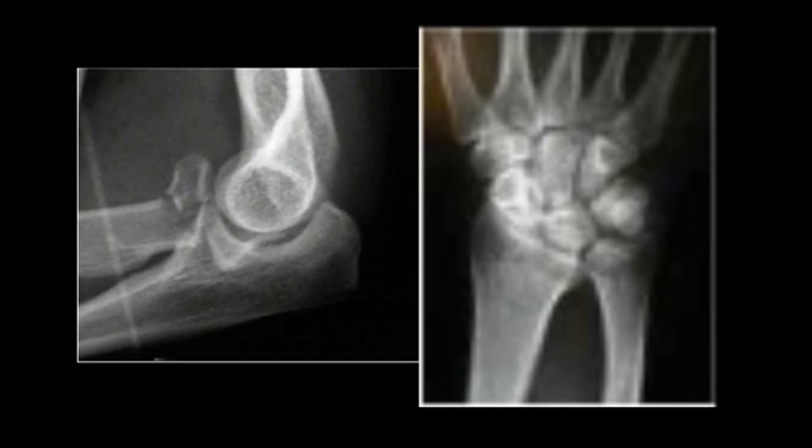What that is, is a comminuted fracture of the radial head with a dislocation of the distal radial ulnar joint, which you could clearly see both of those in the x-ray. What you can't see on the x-ray is that there's an actual interosseous membrane disruption as well.